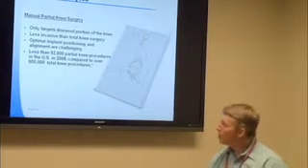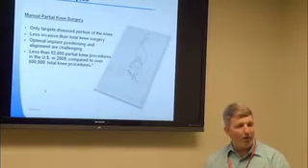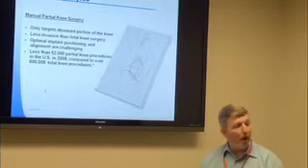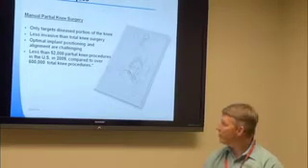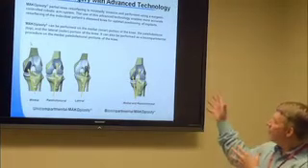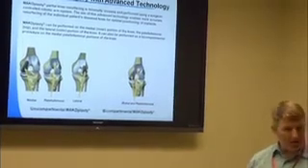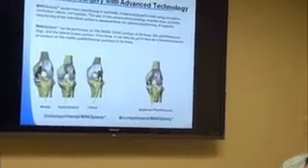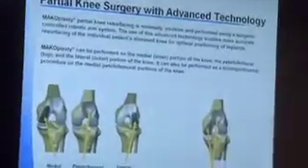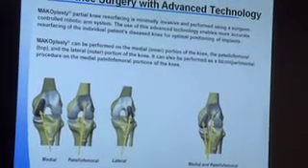And this technology has really kind of helped me in my practice, and I know a lot of my colleagues, kind of fill in the gap there of patients who may not need a total knee replacement, but we've got a good option now for the partial knee replacements. So the idea behind this technology is it's a partial knee resurfacing that's minimally invasive, certainly a smaller incision, certainly a shorter recovery time. The hospital stay is you go home the next day. We keep our patients overnight and then you're home the next day.